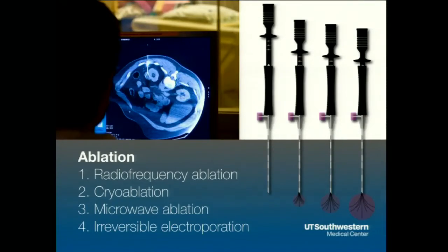Ablations. The joke in interventional radiology is that there are tumors that are resistant to radiation, there are tumors that are resistant to chemotherapy, there are no tumors that are resistant to being cooked. And so ablation is how we either put energy in or take energy out of a tumor and kill it.